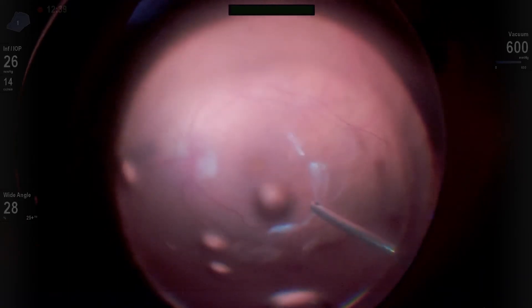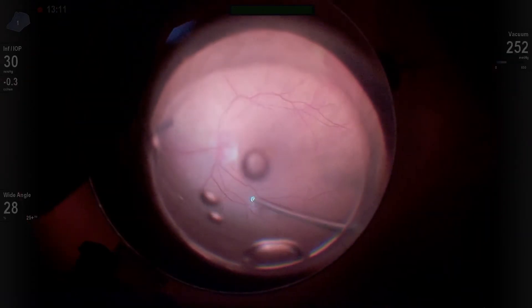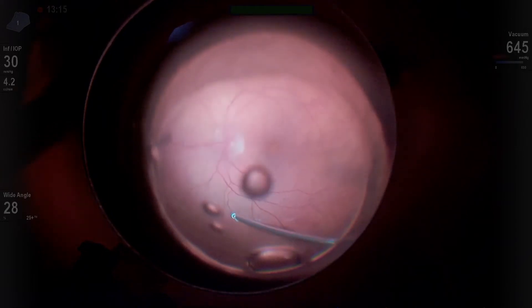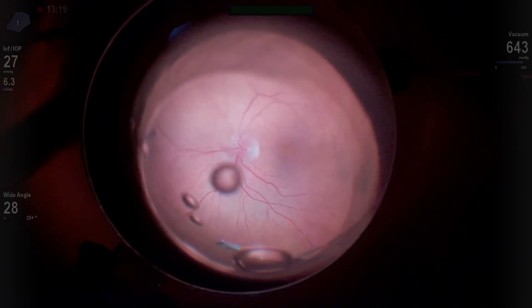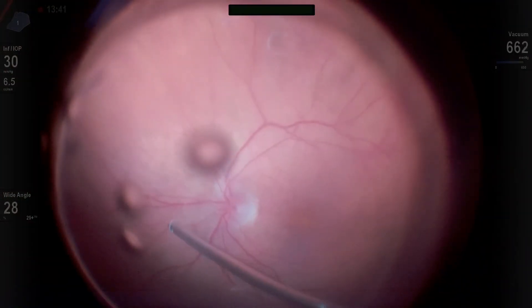These cases can be fairly tricky, and it can be difficult to get the vitreous all the way out past the equator. Sometimes you're just going to shave it down and be done. In this case, we were able to peel it a little bit further, once again going up and out along the eye wall, not just pulling opposite where the vitreous is adherent.